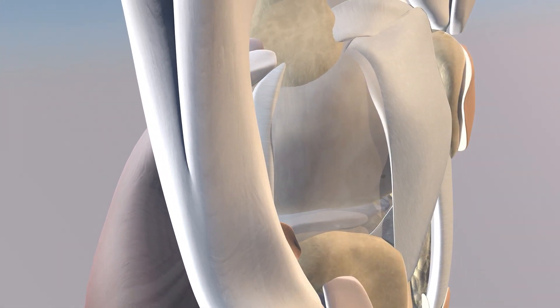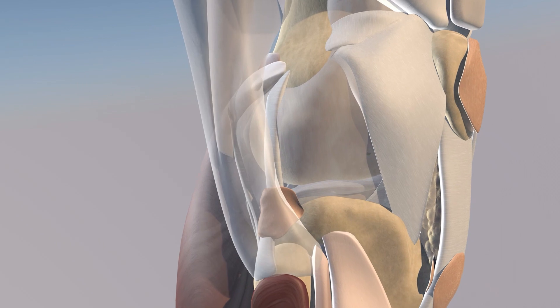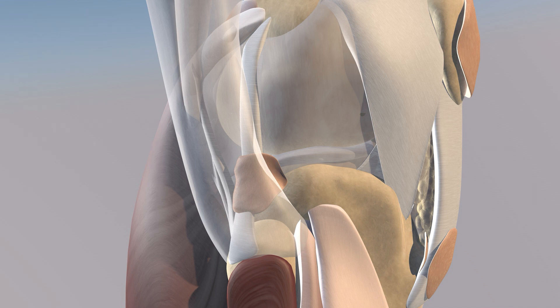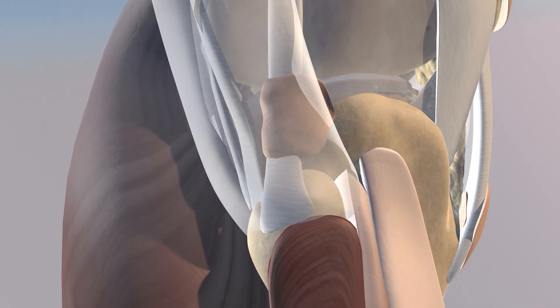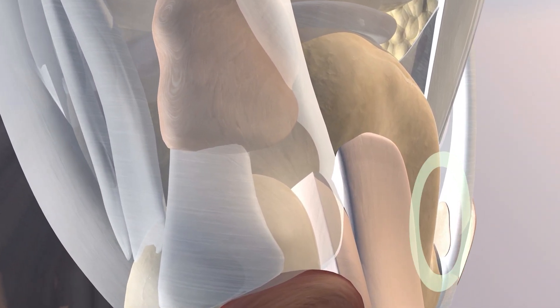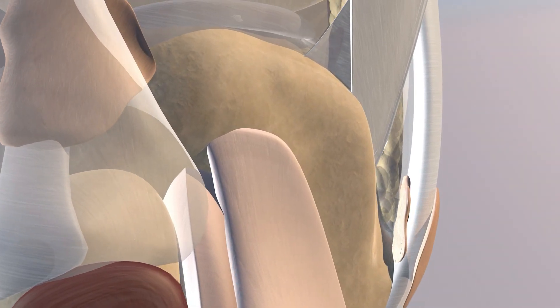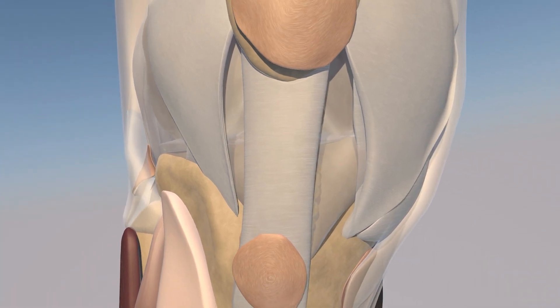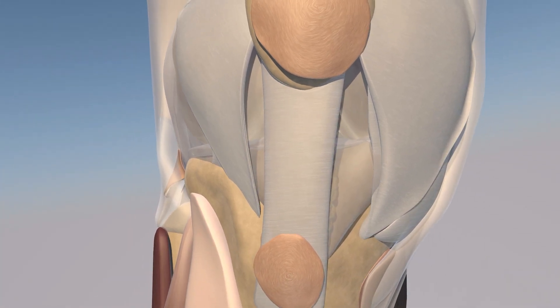Those calf muscles are translucent now, and now we're making those muscles opaque. Here we're looking at the lateral aspect of the knee where you can appreciate the biceps femoris tendon, which we just made translucent, and also the fibular collateral ligament biceps femoris bursa, which you can see draping over the lateral collateral ligament. Here we're getting a close-up view of that bursa. Now we're focusing on a deep infrapatellar bursitis — the bursa is enlarged, somewhat more lateral-sided, which we saw in this patient.